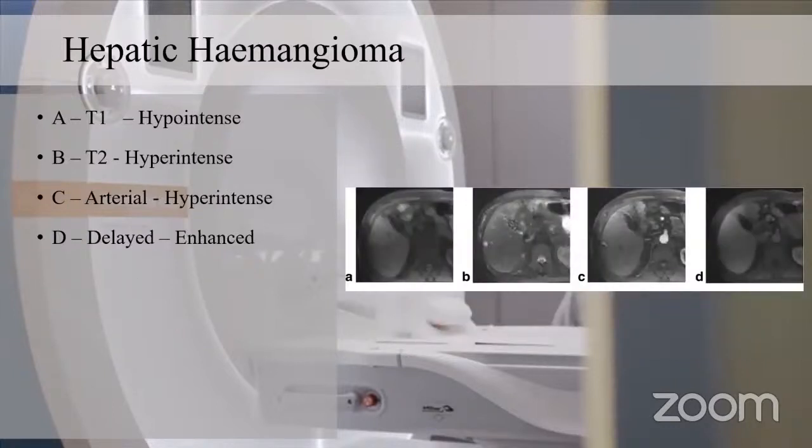Moving to the next, hepatic hemangioma. Here we have the 4 images: T1, T2, arterial, and delayed phase. Hepatic hemangiomas are hypointense relative to the liver parenchyma. So in T1, they are hypointense relative to the liver parenchyma.